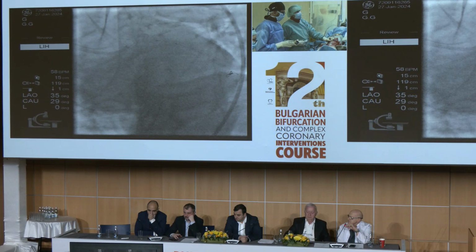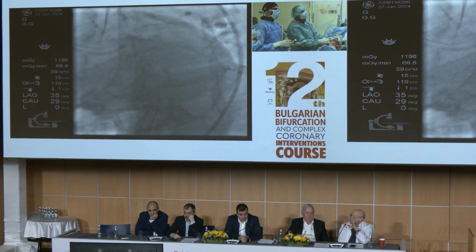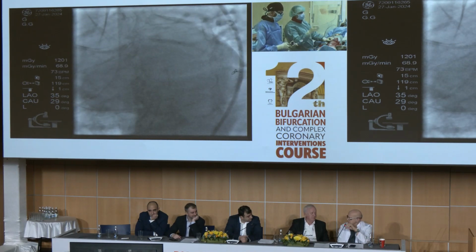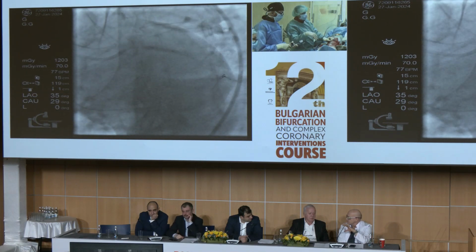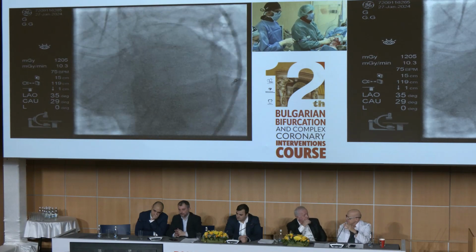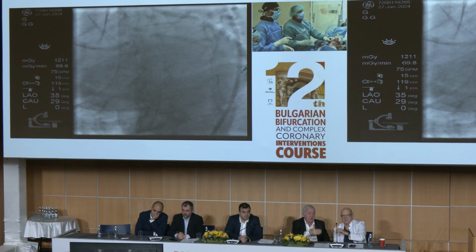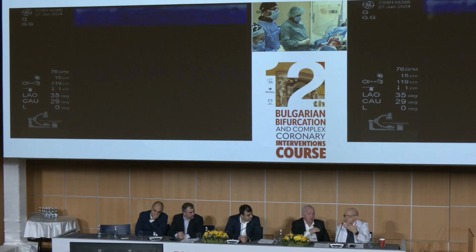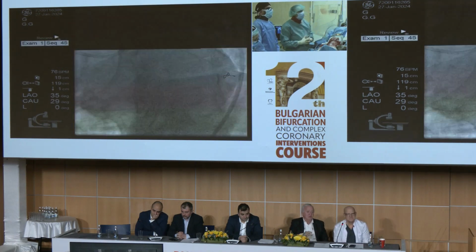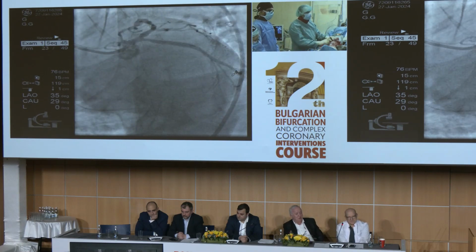And that's why, if I'm not mistaken, there is between 15 and 20% under-expansion of the stent from the nominal number which the producers give. With the first inflation you will never reach the nominal; with the second inflation maybe you reach the predicted. That's all. So if you use a semi-compliant balloon properly, you don't need a high-pressure non-compliant balloon.